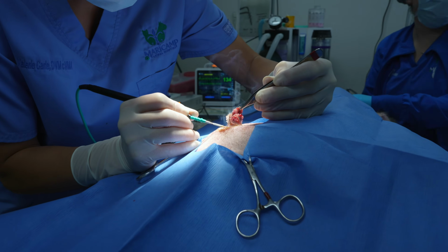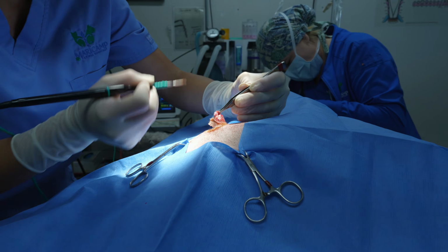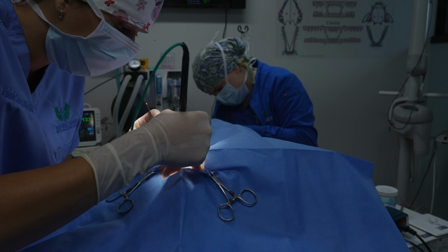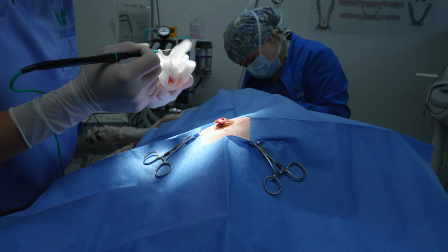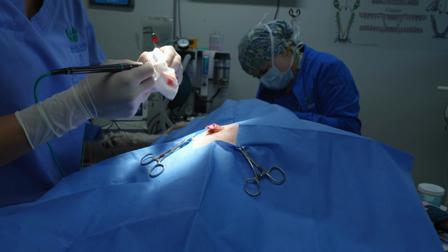Using cautery is really good, because at the same time you are cutting, you're going to have less bleeding on the procedure. All I see is a lot of fat, so that's good. But there are some vessels, like any type of growth, there's going to be a lot of vessels, because those are going to be the ones who are going to feed the growth.